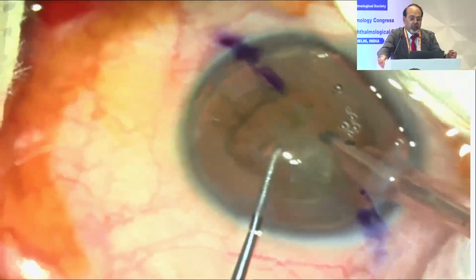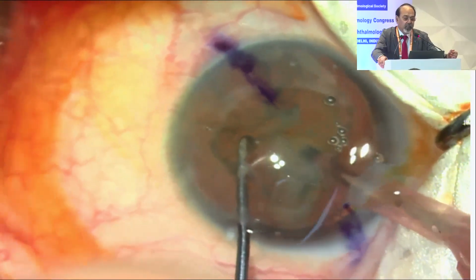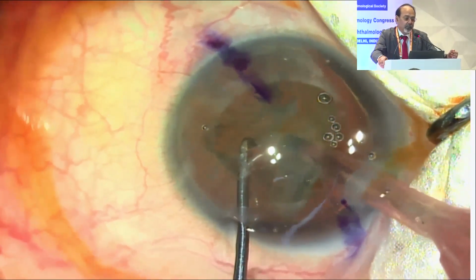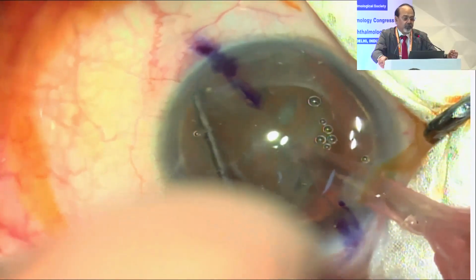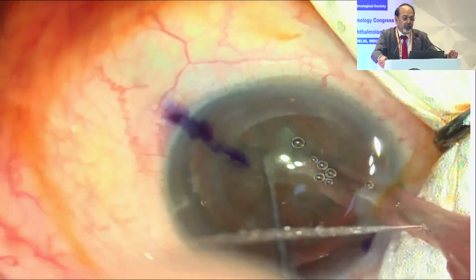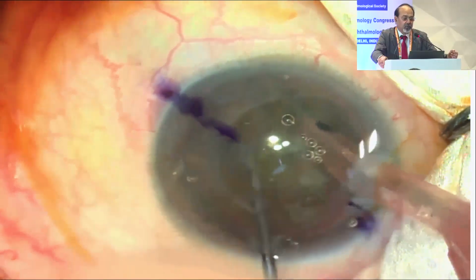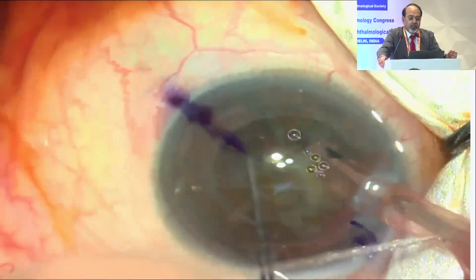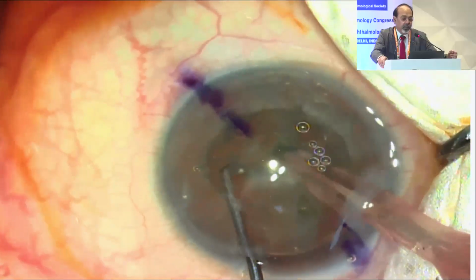And then simple phacoemulsification. I do not normally do capsular fragmentation with the femtolaser, because I find that it sometimes goes deeper than what you expect, and that's not a very good idea. So I chop the lens myself.